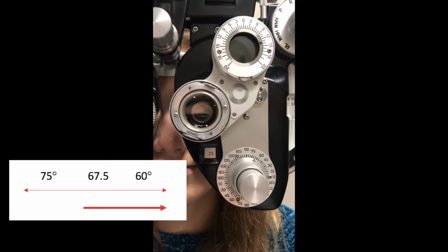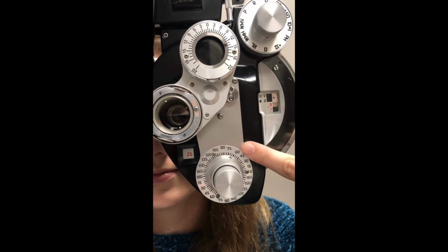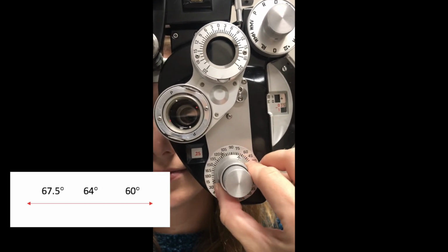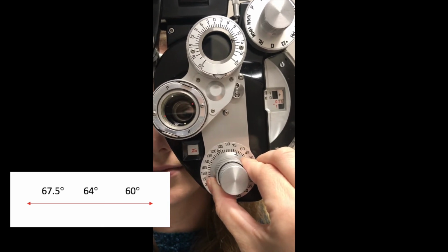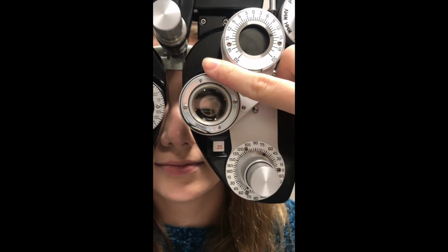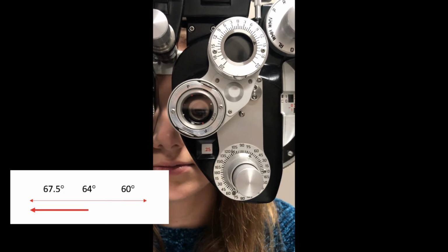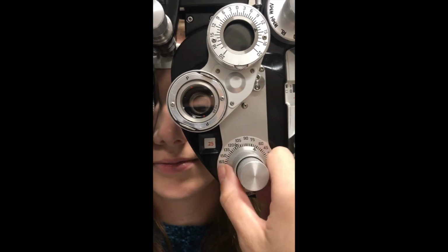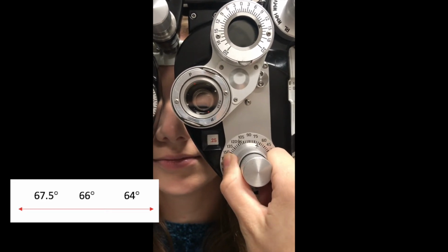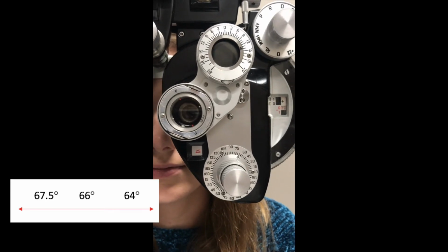Okay, so because Abigail picked red dot, which is to the right, we will now bracket between the middle of 60 and 75, and she preferred towards the 60. So let's go about 4 degrees up from 60. Let's try right there. Okay, Abigail, option 1 or option 2? Option 2. Option 2. Okay, so now we're going to bracket between that and the middle, which we'll just go a few more degrees, about at 66 degrees currently.